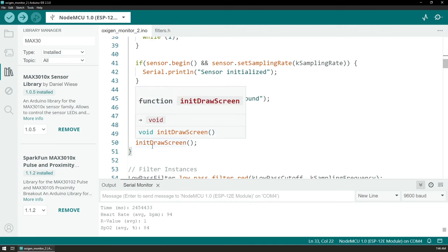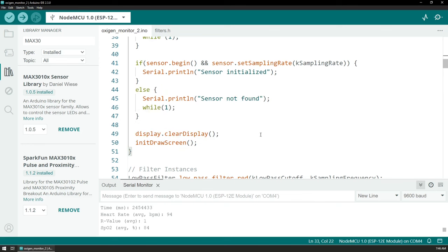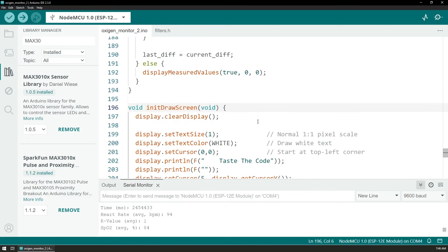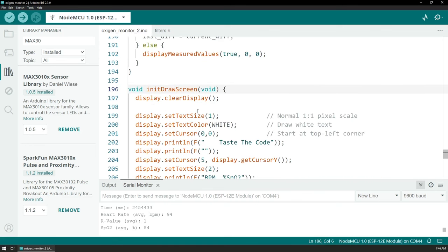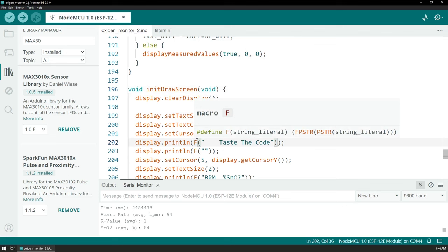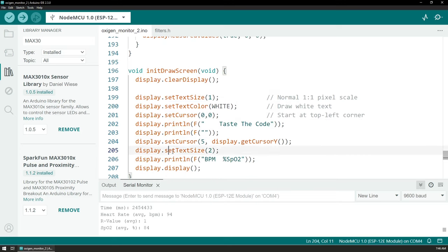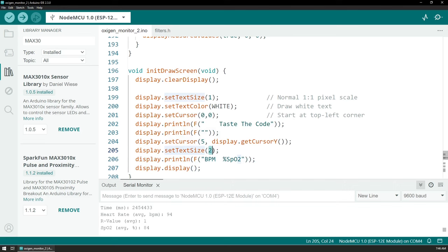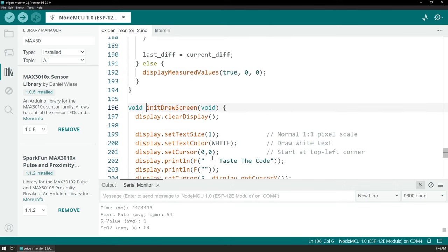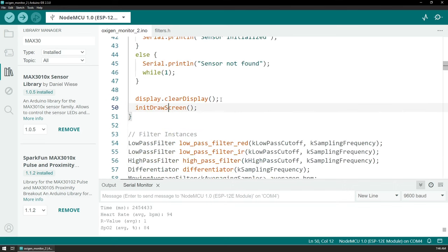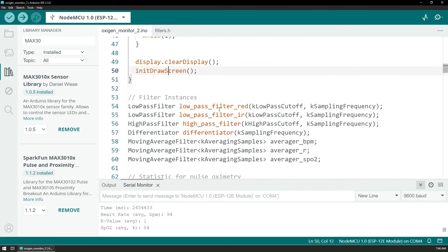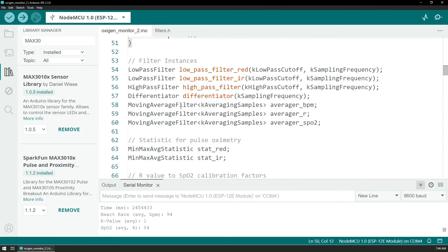I have a function that initially draws the Taste the Code name and the labels for the values on top. We can jump to it to see that. We are setting a small text size and displaying 'Taste the Code' with some spaces in the front to center it on screen, then a blank line below it, and then we are displaying the labels with the slightly higher font so they are more prominent. If we go back, we see here that we have some functions and some variables for the filtering.